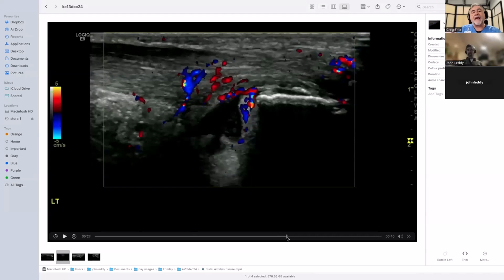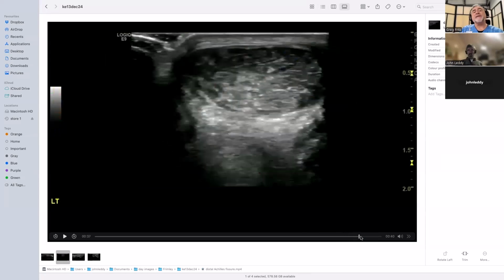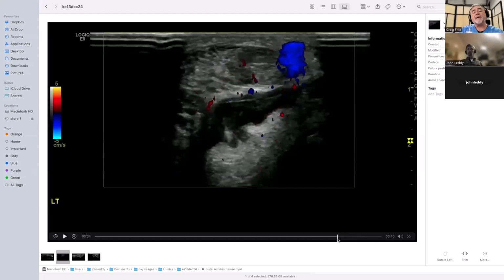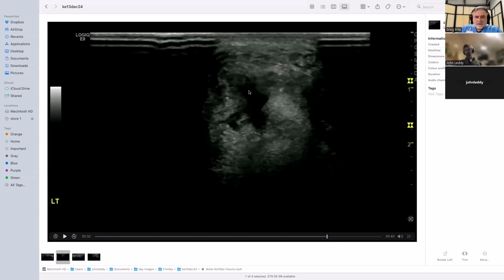For you to say that it does not have the hyperemia that you would expect, would that darker area show more of the Doppler reactivity for you to say that it is hyperemic? Well, it was this low echo area that is within the confines of the tendon. The question for me is, is that a defect in the tendon that is in continuity with the bursa? To see vascularity within that would have disproved that it was fluid.